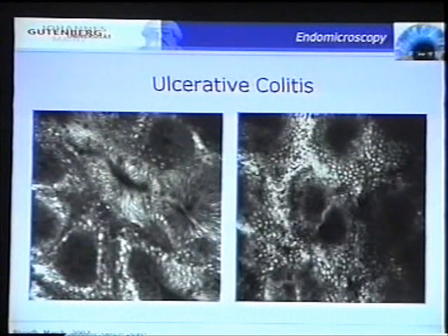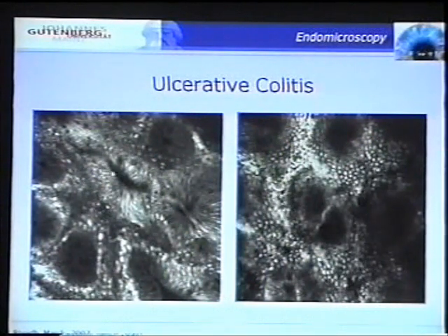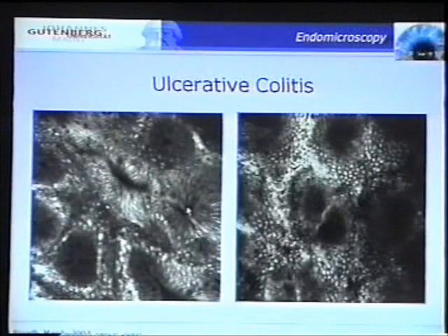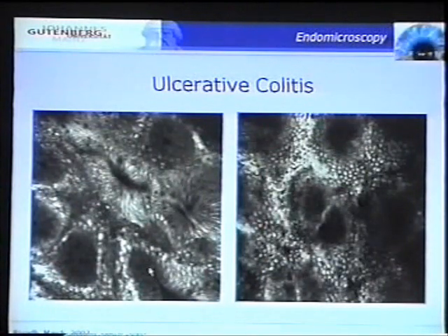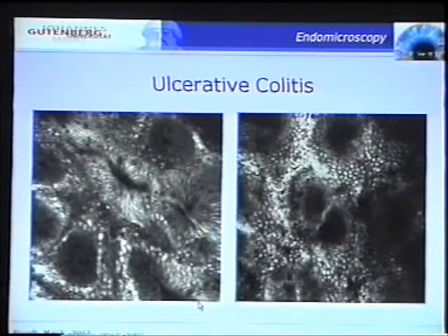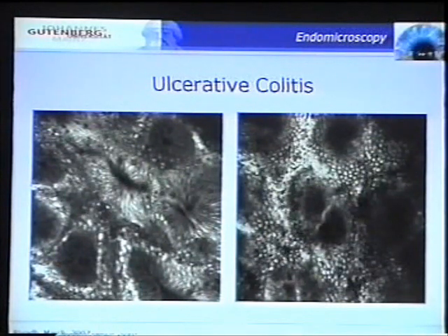This is ulcerative colitis. You see a couple of things: elongated slit-like crypt openings, a fusion of otherwise regular crypts, and those star-shaped crypt openings — basically corresponding to type 2 of the pit pattern.